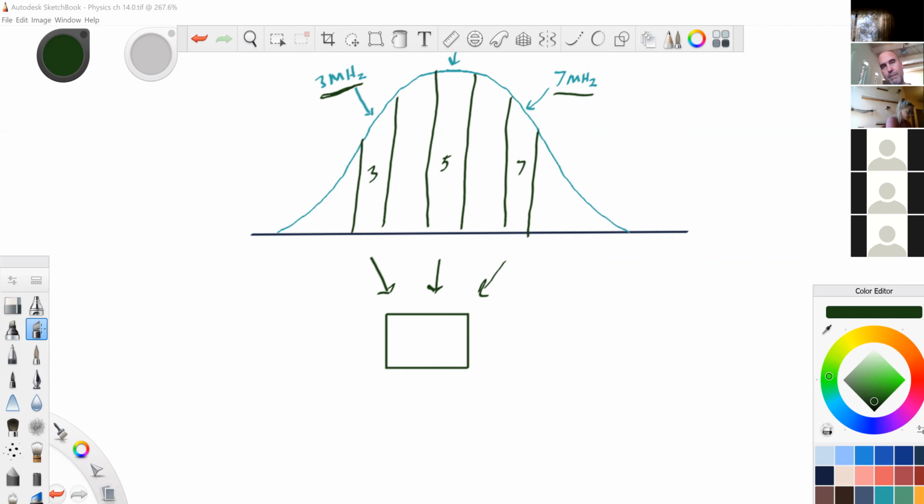And so when we process these 3 frequencies separately and then put them together, the machine's able to say, oh okay, here's what 3, 5, and 7 agree on, but then here's what these three frequencies don't agree on, and what they don't agree on is rejected. And so by being able to do that, you're able to reduce noise, you're able to reduce some speckles. So let's see, we call it wide bandwidth, broadband, or broadband.